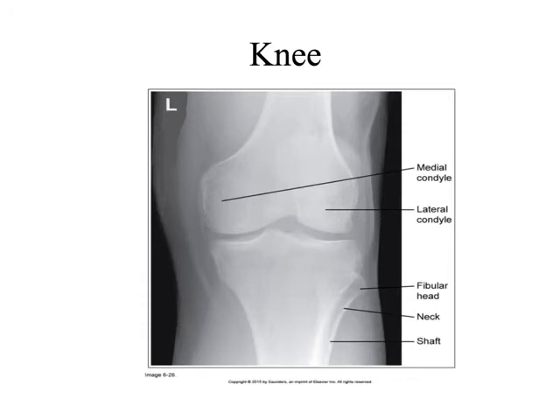It's actually a really difficult thing to image. So what are some of the things that y'all are learning in the clinical site to help you center on the knee joint appropriately? What kind of tricks are you seeing? Have they shown you any tricks? Just to feel for the indentation. Feel for the indentation and center more or less on that indentation. It's always weird to me because the knee joint is actually a little bit below the kneecap, right? So we can't really go off the kneecap. It hinges below the kneecap, beneath the patella.